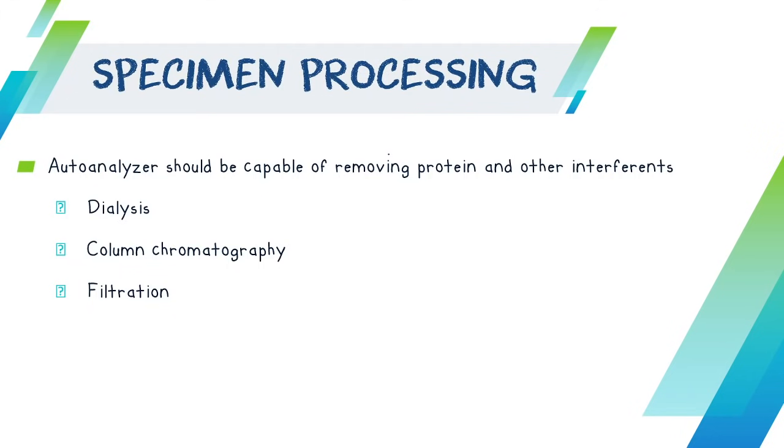One problem that protein poses is, number one, its size. It can block other substances because of its size. Another reason in terms of our auto-analyzer is that it is very common for it to cause blockage in your tubes, your probes, your tubings, in your analyzer. Especially if you are not fond of cleaning first thing in the morning before you use your machine, this could really cause a problem, because it gets trapped on the side of your tubes.